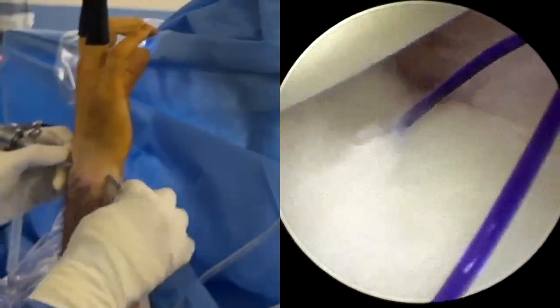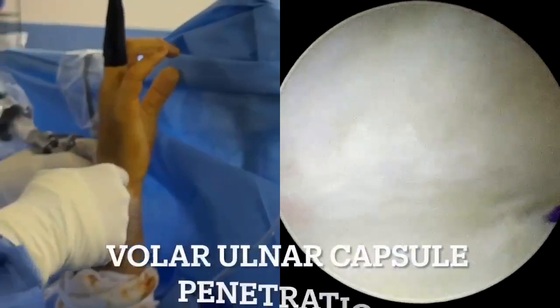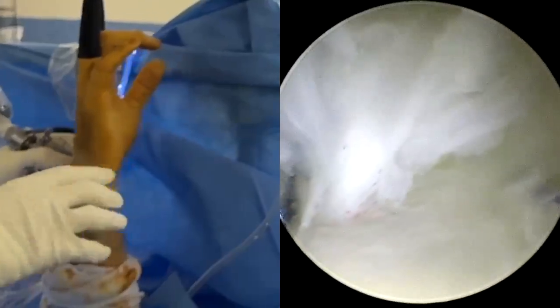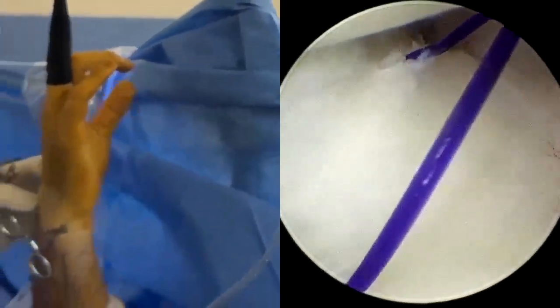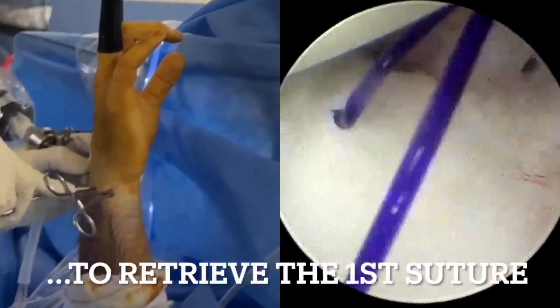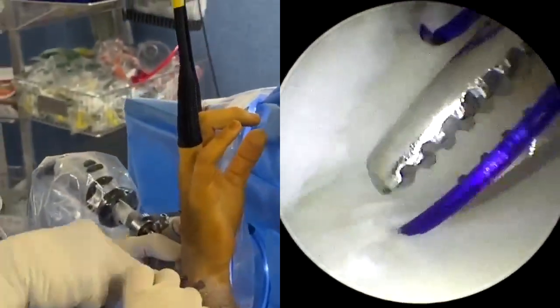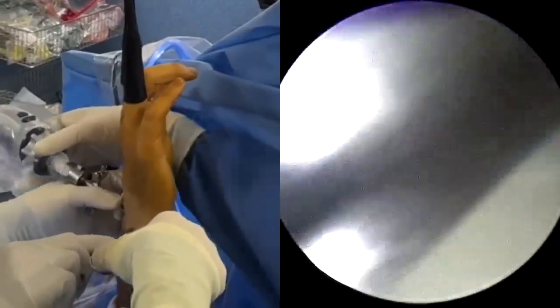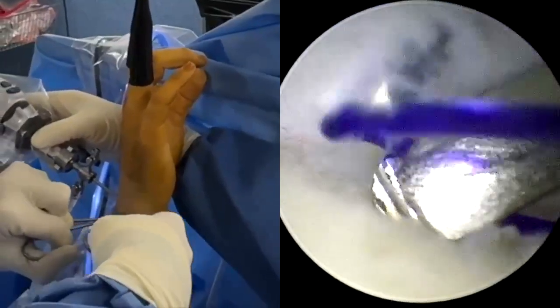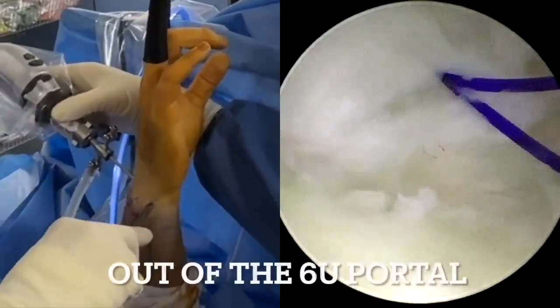The curved hemostat is then inserted into the 6-U portal, positioning it volar to the ulnar carpal ligament complex and the volar capsule, following the previously created soft tissue plane, and perforates the capsule to retrieve the first end of the suture. The first end of the suture is reintroduced into the 6-R portal to facilitate the suture retrieval process. The suture is then retrieved out of the 6-U portal, volar to the capsule.